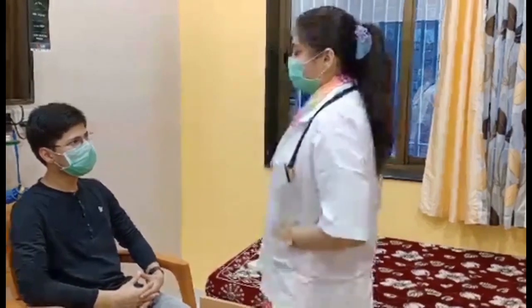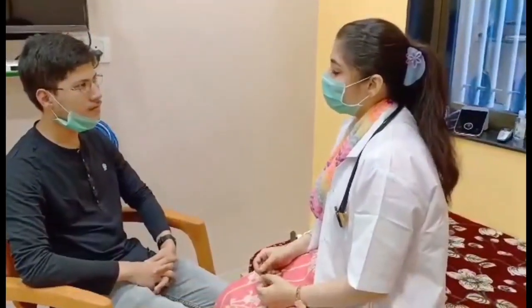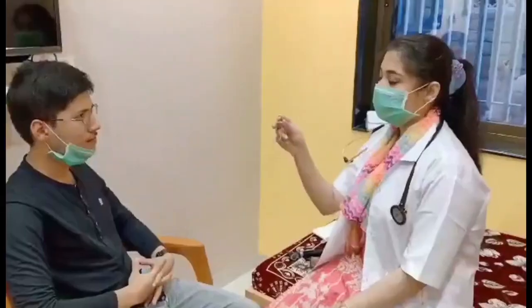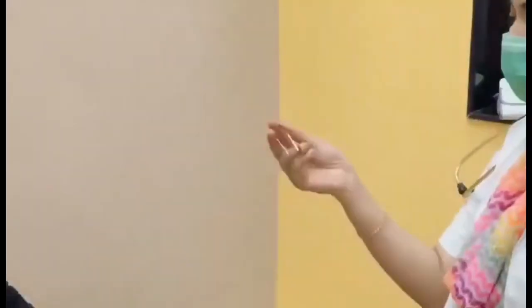I'm going to perform anterior rhinoscopy. I will inspect your nose. Have you got any pain or tenderness around your nose? This is a nasal speculum. I'm going to use the nasal speculum to examine your nasal cavity.